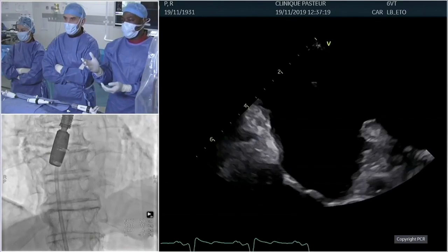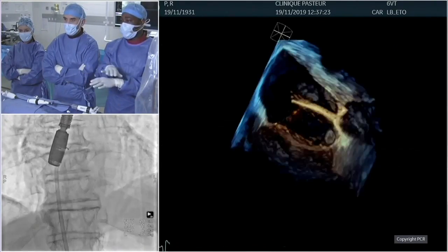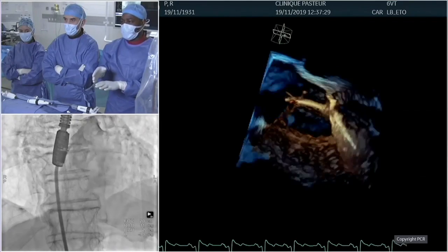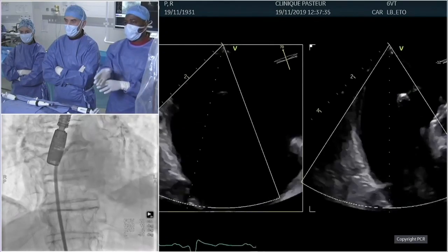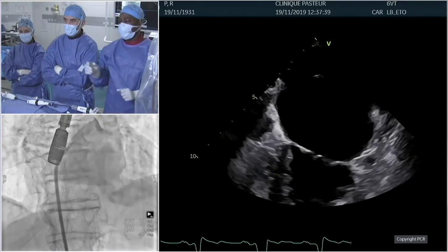And now what we're going to demonstrate is to try to remain parallel with the tip of the guide sheath, just to be sure that we are going to navigate in a really perpendicular fashion towards the mitral valve, and then we won't need to correct too much in terms of height, gain, loss, just to be perpendicular. So we're going to see that. We just wait for the 3D.